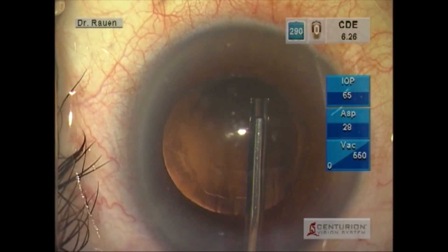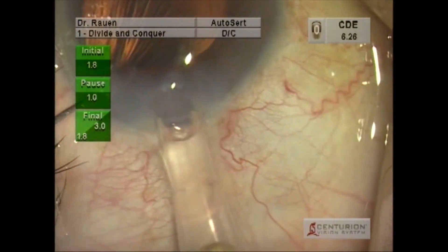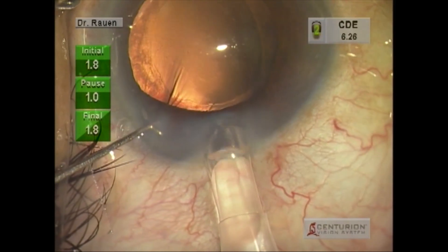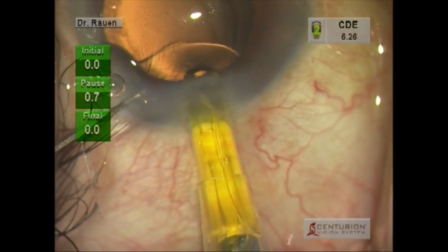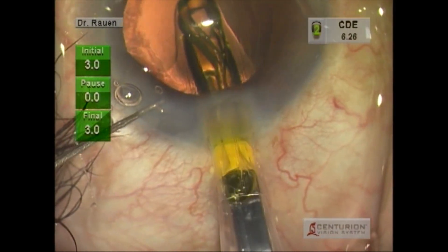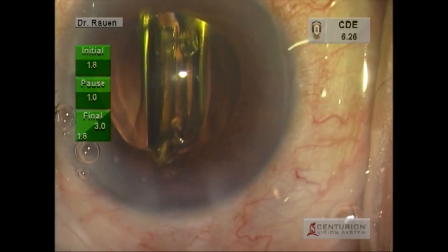One of the other neat additions to this cataract system is the introduction of the auto insert device by Alcon. You can see it here delivering a single-piece acrylic lens, all controlled with the foot pedal. There is a brief pause within the wound, and at any point delivery could be delayed.